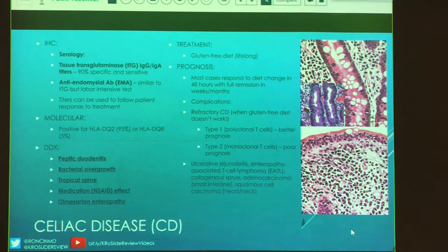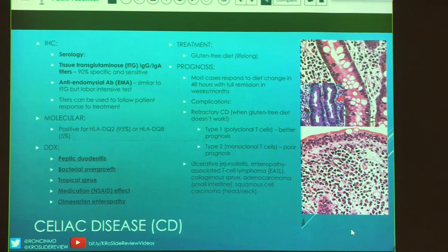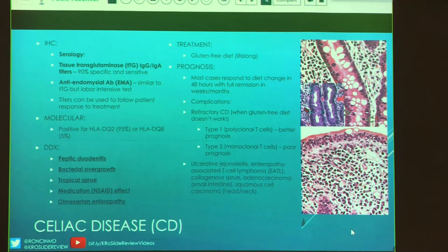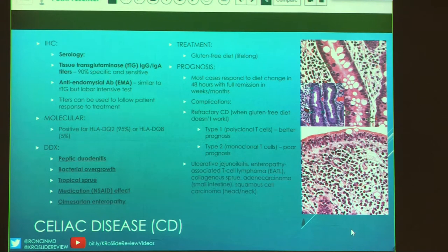One of the other things present in this case is crypt hyperplasia — increased mitotic activity within the crypts. You can see neutrophils in lamina propria if there's peptic duodenitis involved. They can occur together but also look very similar, so be aware of the differences. For figuring out if it's celiac, IHC is not really helpful. CD3 is not going to help you. What will help is serology: tissue transglutaminase IgG or IgA titers — specific and sensitive — or anti-endomysial antibody, which is labor-intensive.